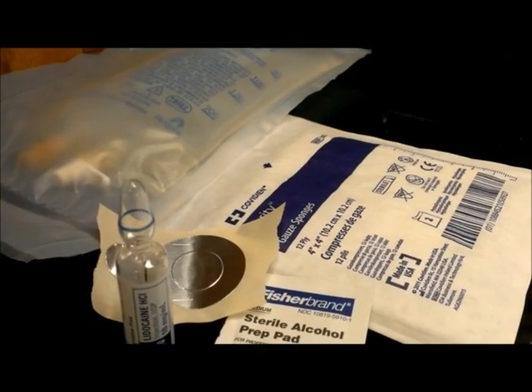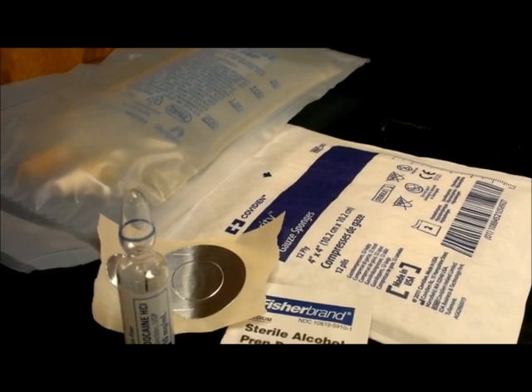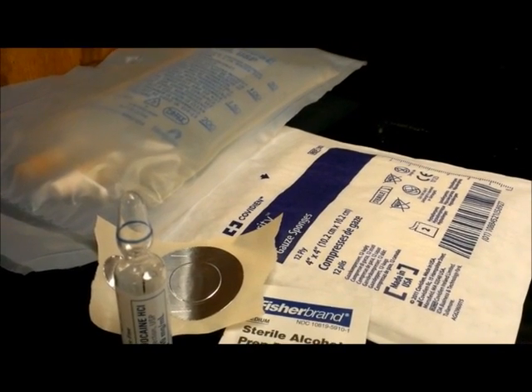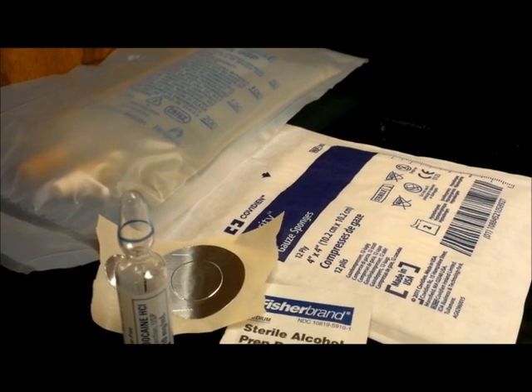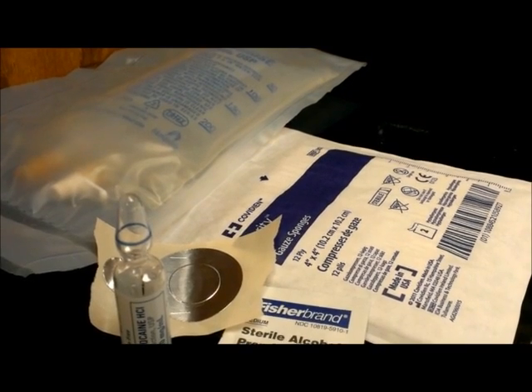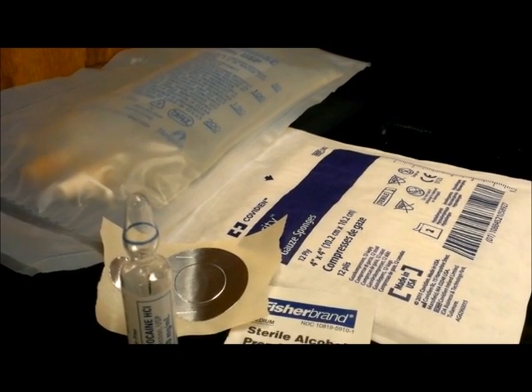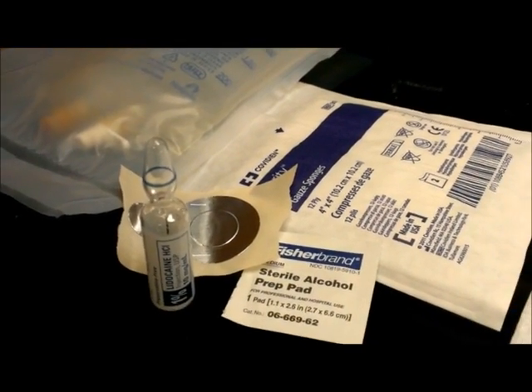Today we are going to show you how to correctly and safely withdraw medication from an ampule and inject into an IV bag utilizing aseptic technique. We will first demonstrate step by step outside of the hood so that you can closely see how to break an ampule without injuring yourself. We will demonstrate a few different techniques and explain why we prefer our final method. Then we will move into the laminar flow hood to demonstrate aseptic technique.